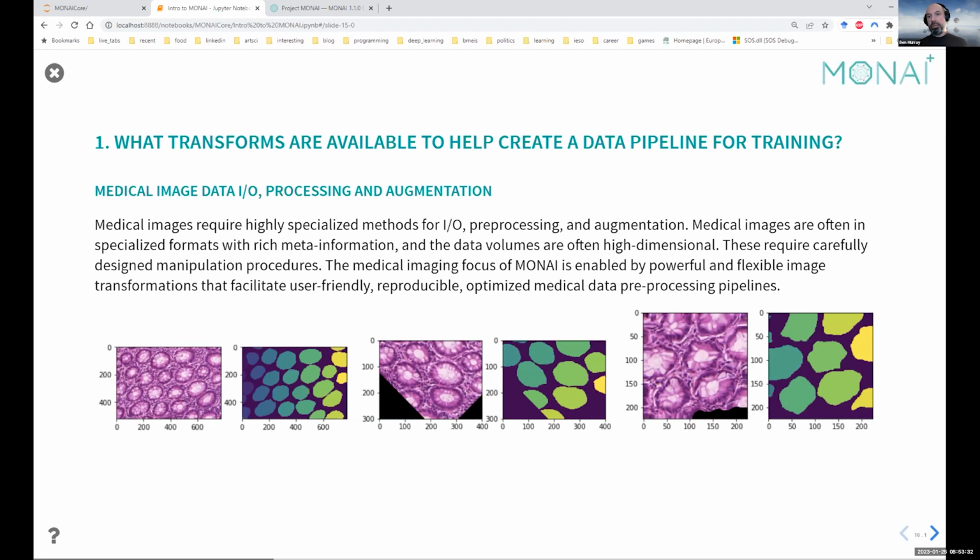And if they are, then they can typically be much larger than typical images, so you might need some patch-based transforms. And if they're 3D data, of course, then typically networks cannot necessarily run on the full volume, so we might take patches for those. But also because the data is not your typical RGB 3-channel data, there are different kinds of transforms that you might want to apply to it.